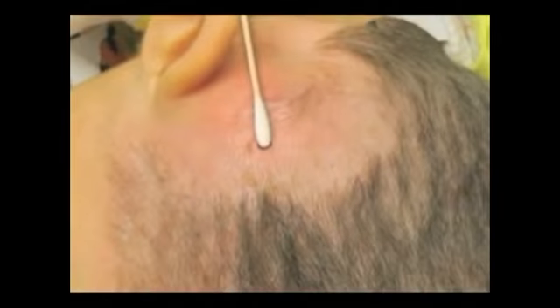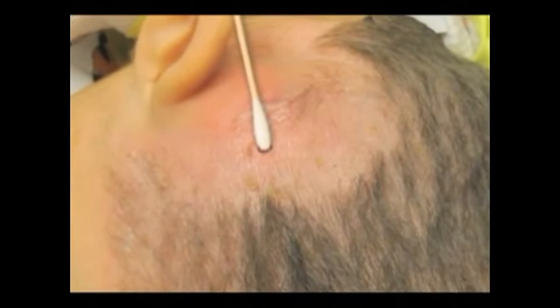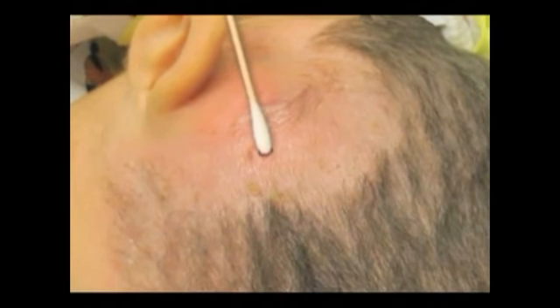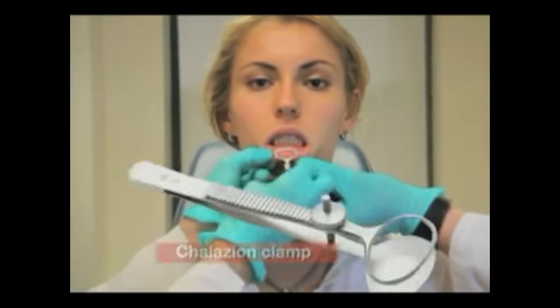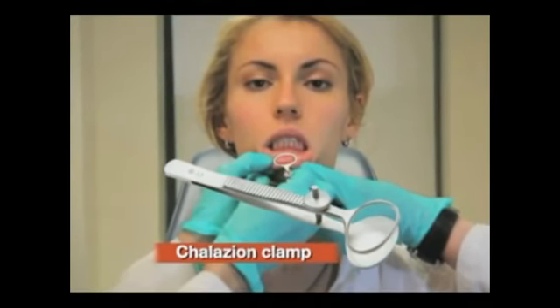When taking a specimen from the highly vascular scalp, be prepared for brisk bleeding, as shown earlier. The bleeding can be easily controlled with the application of pressure and the placement of the first suture. When performing a biopsy on the lip, which is highly vascular and extremely pliable, use a Chalazion clamp to allow for easy handling and intraoperative hemostasis.